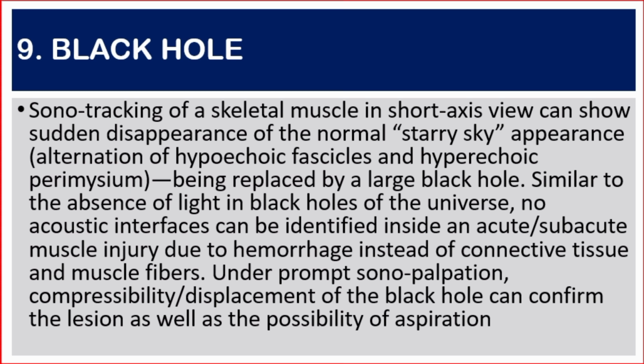No acoustic interfaces can be identified inside an acute or subacute muscle injury due to hemorrhage instead of connective tissue and muscle fibers. Under sonopalpation, compressibility and or displacement of the black hole can confirm the lesion as well as the possibility of aspiration.